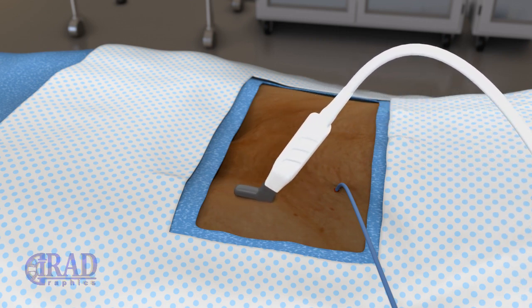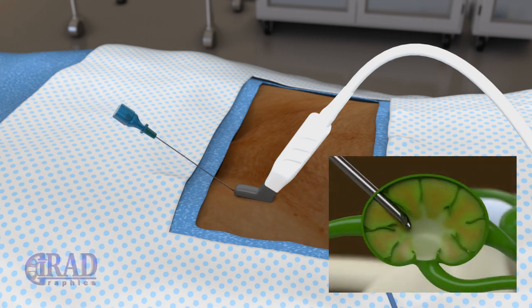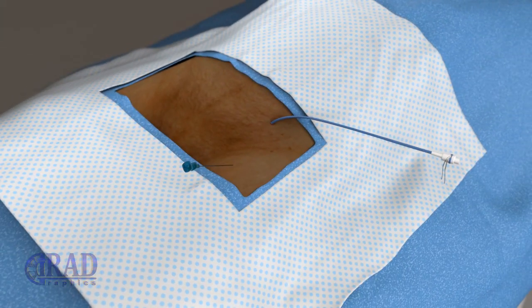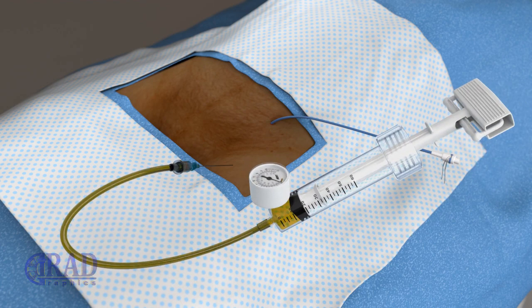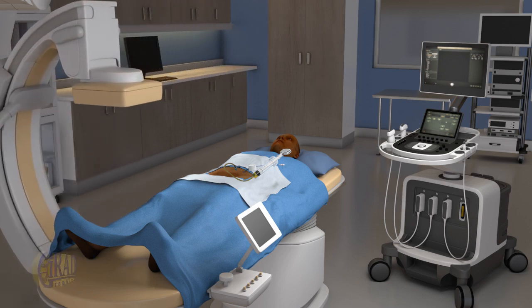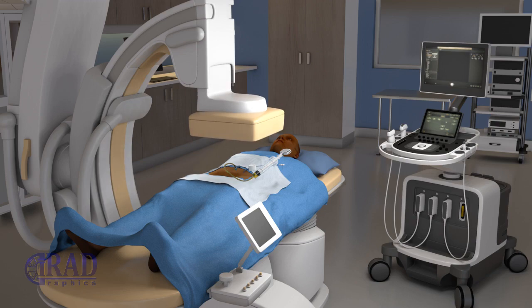First, a groin lymph node is identified under ultrasound guidance and subsequently accessed using a needle. The stylet is removed and the needle is connected to an injector which contains contrast. Subsequently, the arm of the fluoroscopy unit is moved over the patient.